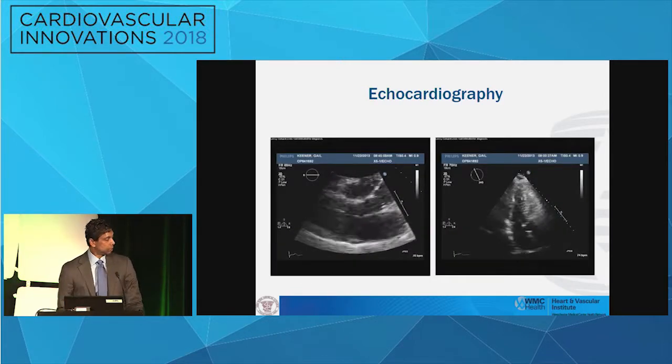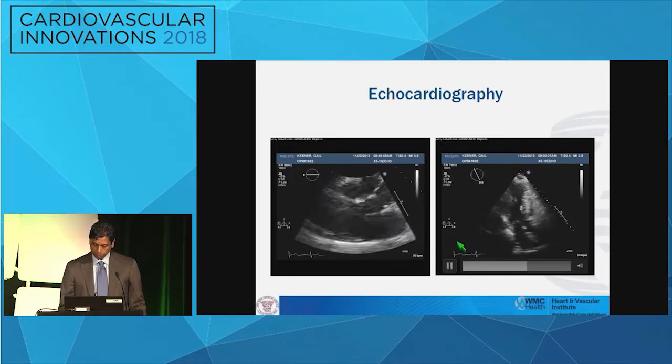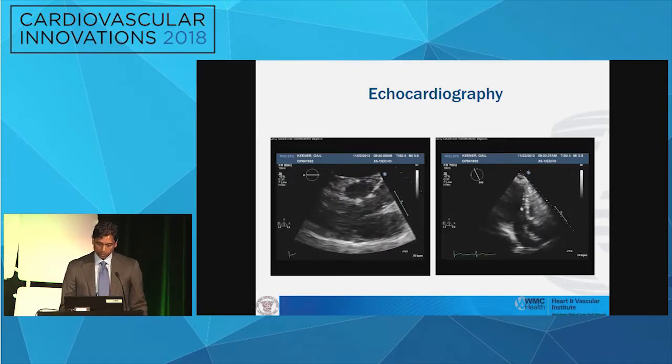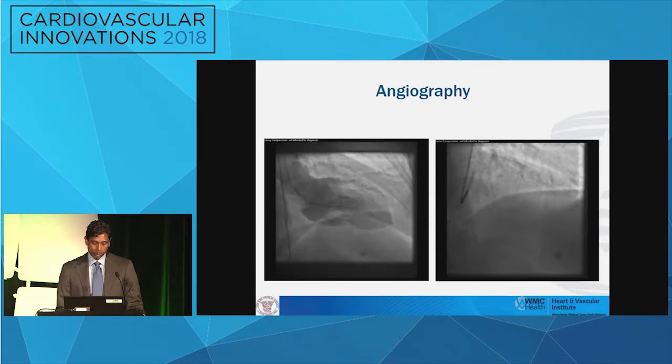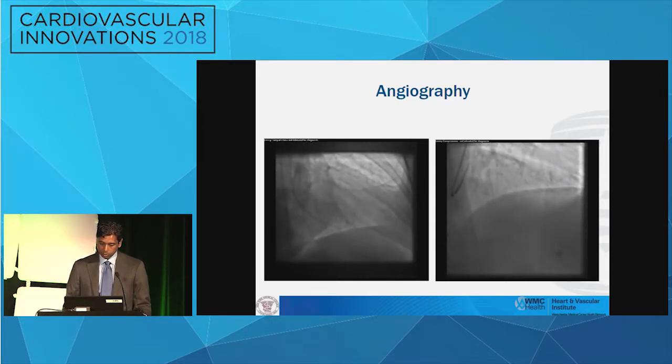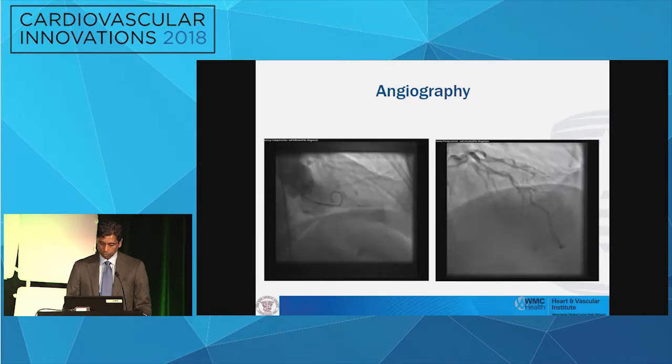So you can see here that you have a basal septum that has an echogenic area, so you can target this area with alcohol ablation. There's no MAC or anything that's contributing. The septum is somewhat thick, but not enormous. You can see SAM over here, the obstruction in the outflow tract. Here's a V-gram on the left, very hyperdynamic function, which is typical in this patient population. Certainly also with pulmonary disease is also very typical, and you can see a first septal perforator that's pretty big.